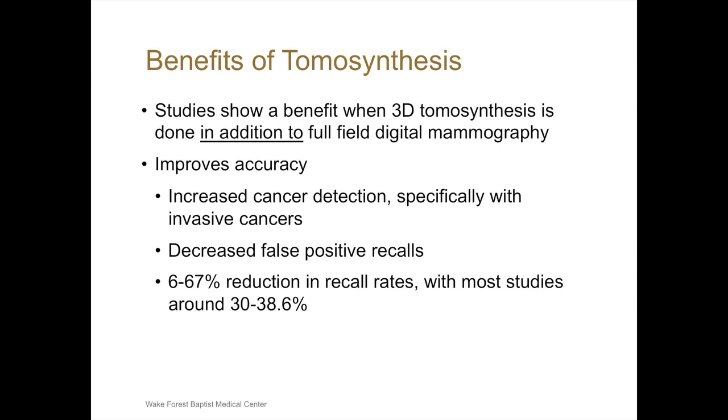That's important. But it can also decrease our false positive recalls. Remember, we want to do better with that. We want to decrease patient anxiety. Studies have shown somewhere between a 6 to 67% reduction in recall rates. Most studies show between 30 and 40%.